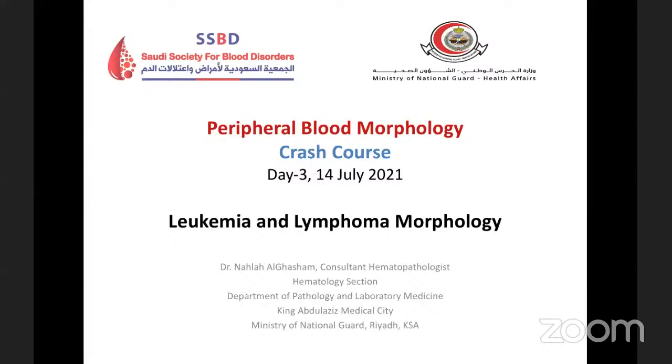Today I'll talk about leukemia and lymphoma morphology, the peripheral blood morphology in the blood smear. As you know, this is a very big topic. Leukemia and lymphoma is a heterogeneous group of diseases. We have a dedicated book, the WHO classification for hematopoietic disorders, so it wouldn't be logical to present all the morphology.